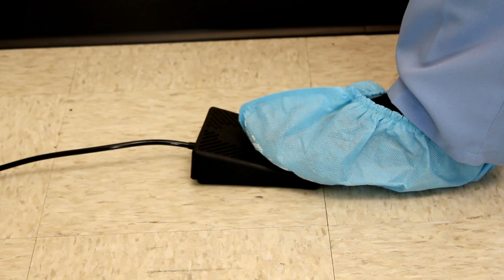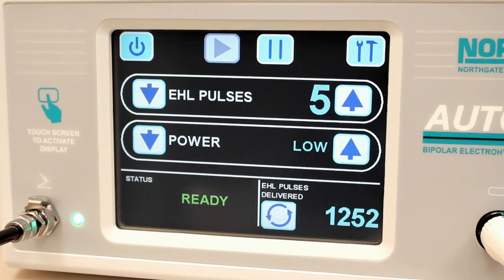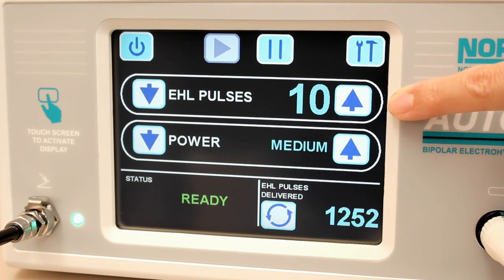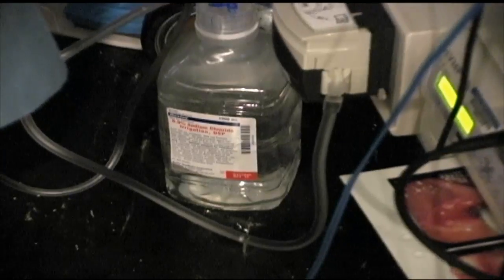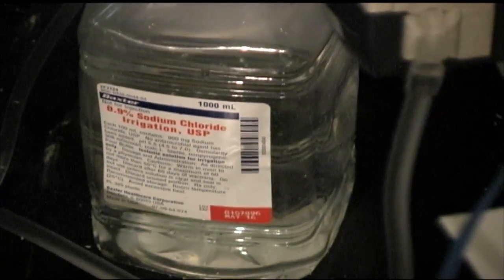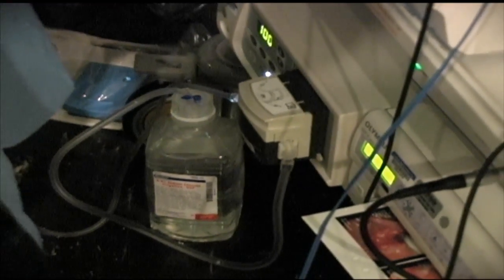The physician can then step on the foot pedal to start firing the EHL pulses at the stone. To release another burst of EHL pulses, the physician should completely step off of the foot pedal and then step back down again. The power and number of pulse selections may be modified as required between EHL pulse applications until the stone has been fragmented. To periodically clear the immediate field of view of fragmented stone debris, simply infuse additional saline from the fluid delivery pump. This is controlled from a foot pedal located on the floor.